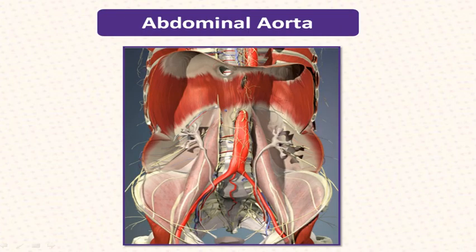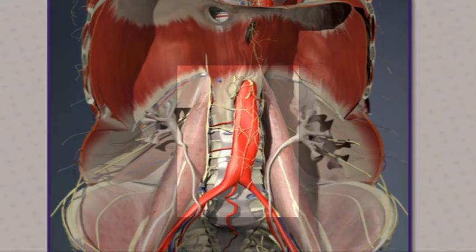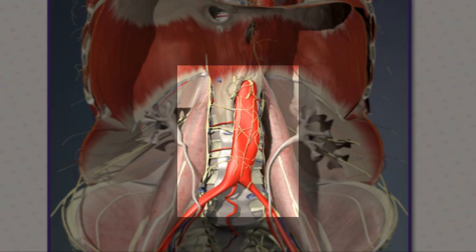The target of bedside evaluation of the aorta is to determine the presence or absence of an abdominal aortic aneurysm. To do so implies that we can see the full length of the intra-abdominal aorta and make clear determinations of its diameter along the way. In point-of-care assessments, we are most interested in identifying the course of the aorta from its most proximal origin at the diaphragmatic hiatus all the way to its ultimate bifurcation into the iliac arteries.